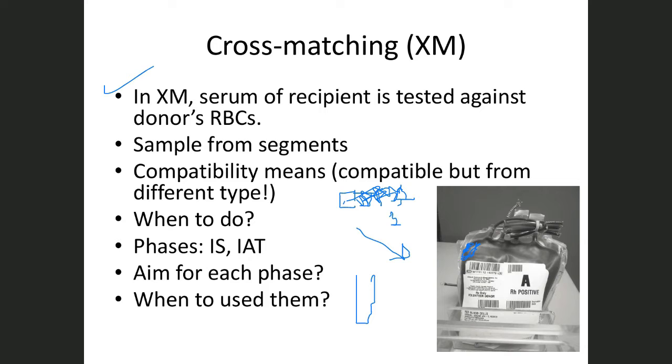So we don't open it, okay, as Uhud said, because we want to avoid contamination, because remember, we transfer blood from vein to vein, so it's a closed system. Okay, so we never ever open it. Okay, can you notice something here? Let's change the color. Can you notice something here?